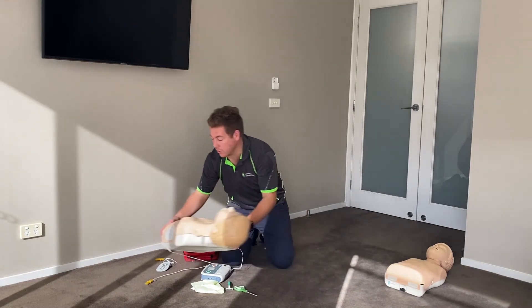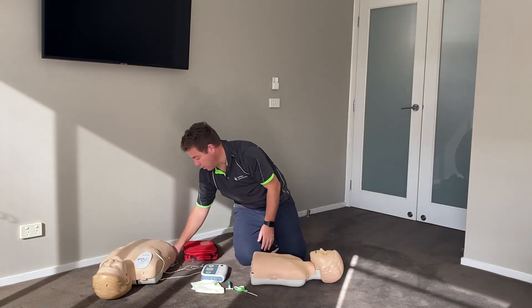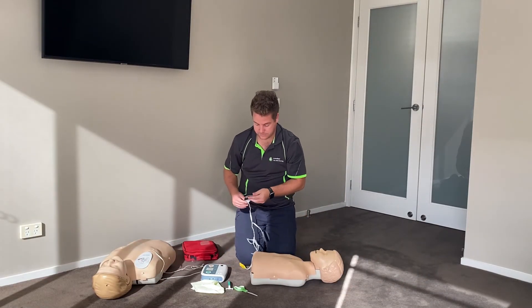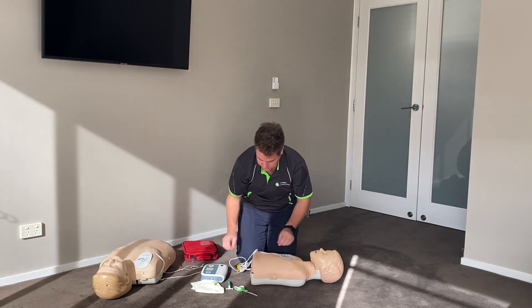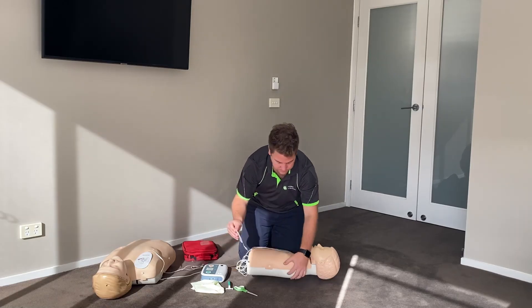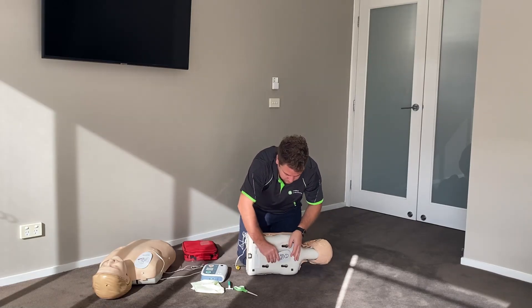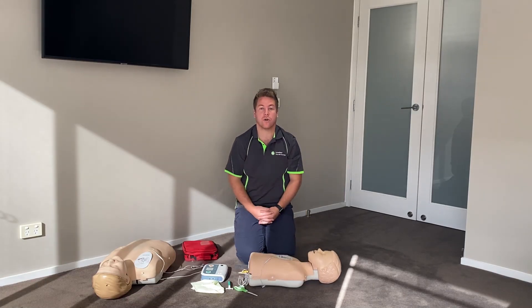For a child, the child pads will go on the front and on the back. Again, this is so the shock goes straight through the heart.